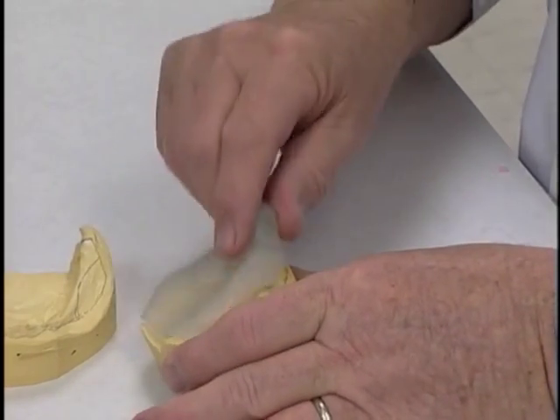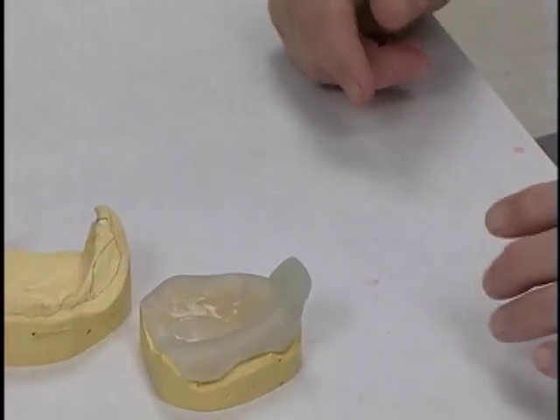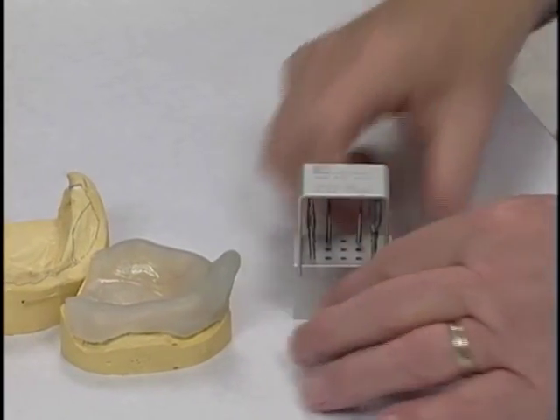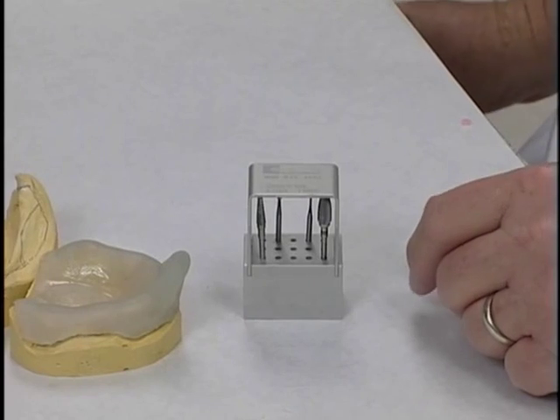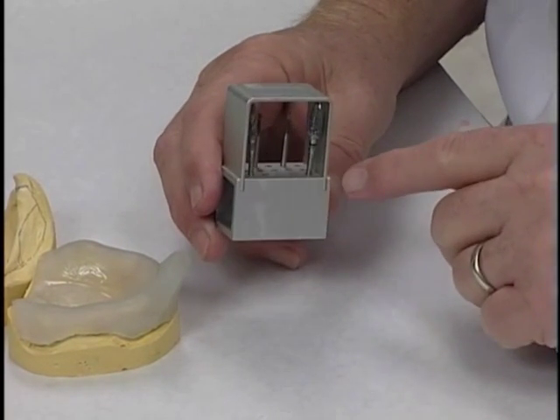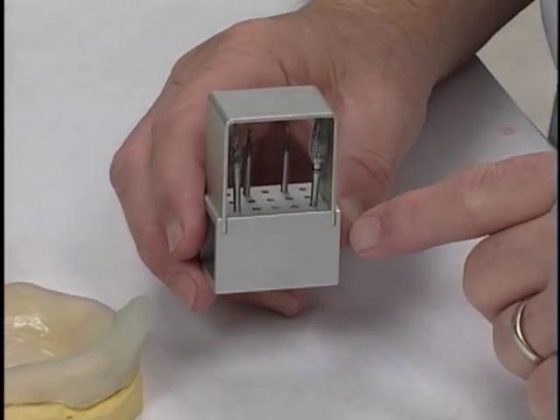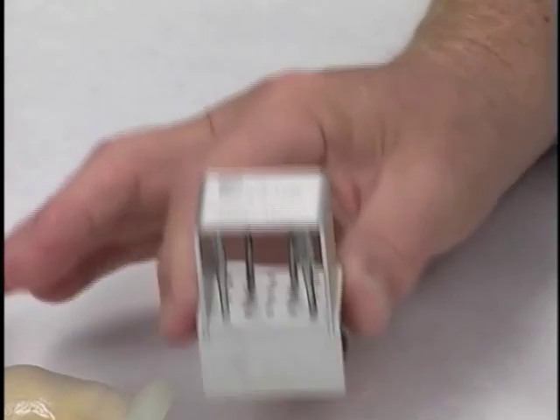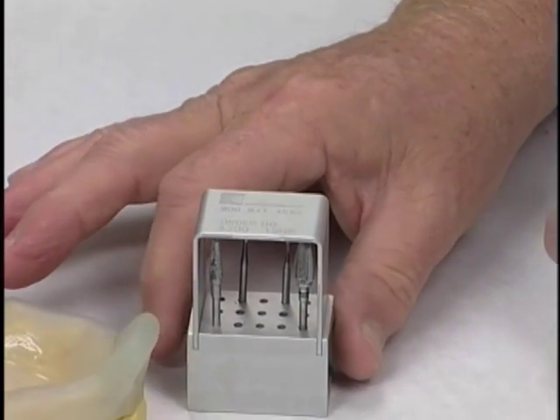We do that by means of some acrylic burrs, which are from the Brasseler Corporation. The university buys these from the Brasseler Corporation, and we keep them in a little container like this that can be sterilized for clinical use.